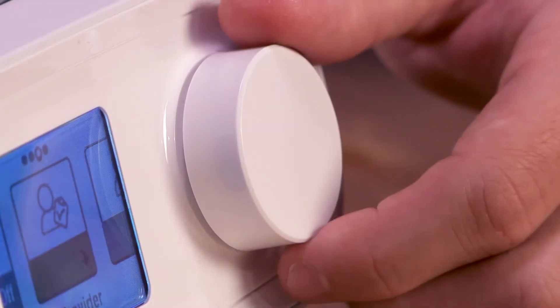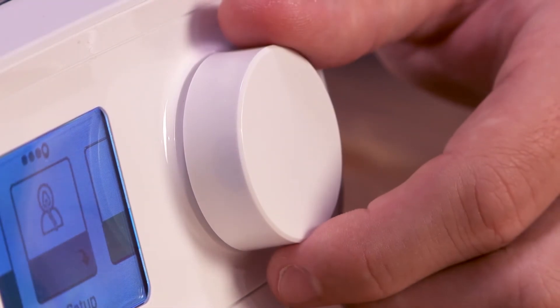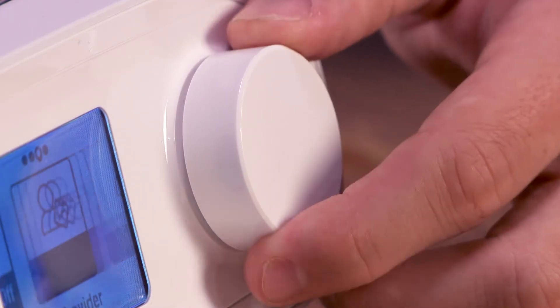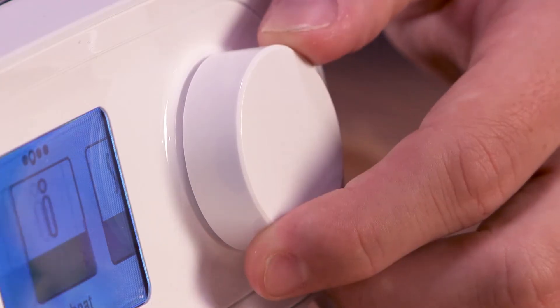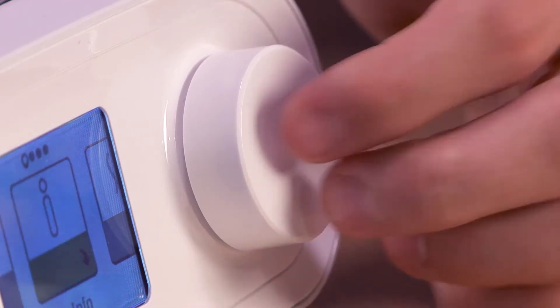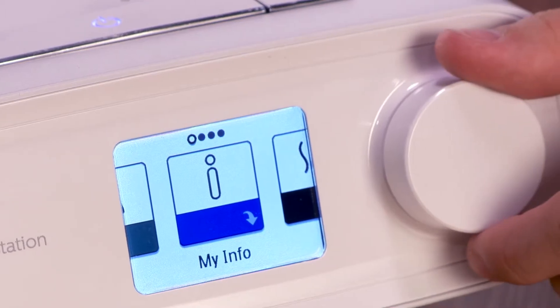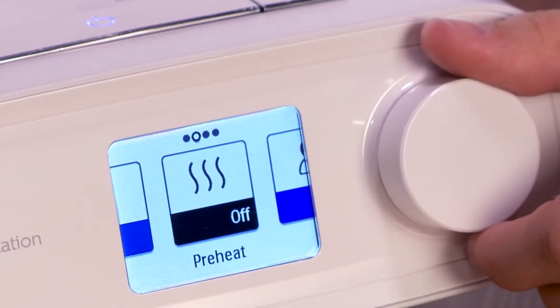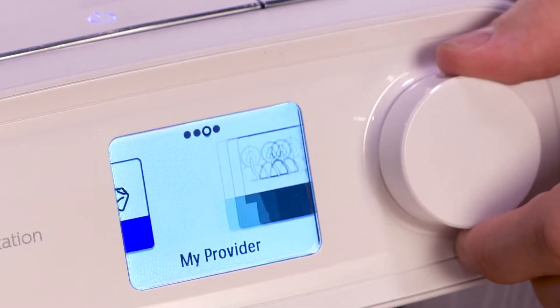DreamStation's intuitive user interface lets you adjust settings and view information about your therapy. With your therapy turned off, you can scroll through menu options by rotating the dial. From the home screen, there are four menu options: My Info, Preheat, My Provider, and My Setup.